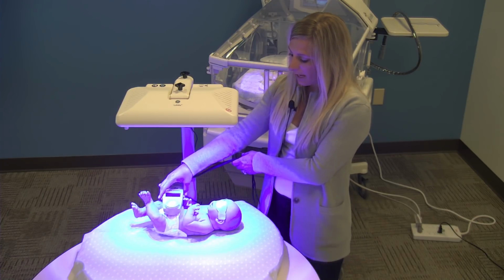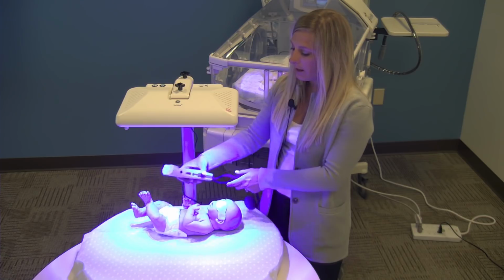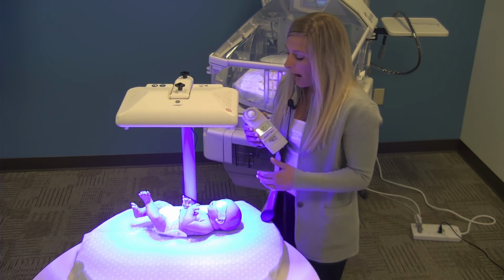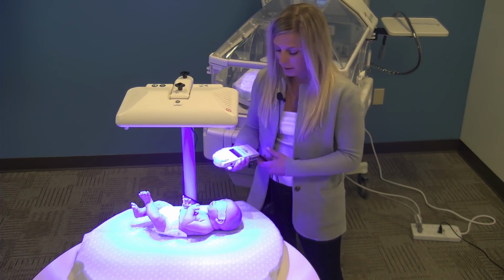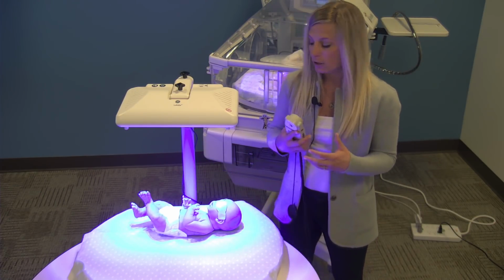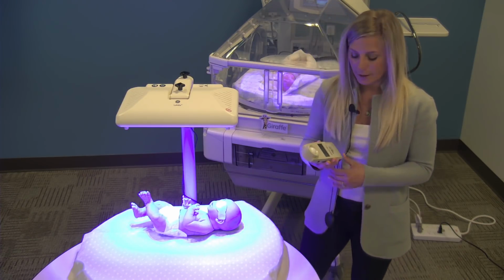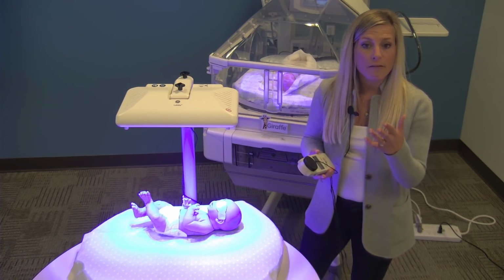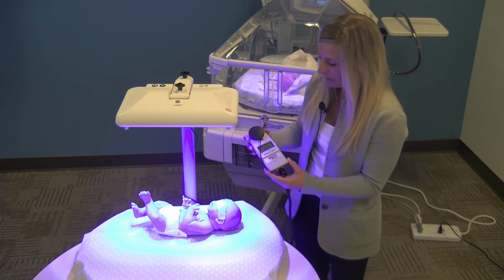And now we're going to put this at the level of the infant, and I can go ahead and lock that into place and show you all. So we get a 42.1. Now, we're showing you today just that one spot. Some places do a multi-spot and then take the average. So what that would look like is if we did, say, a 4-point check. Again, not going to do the math, but you'll get the idea.